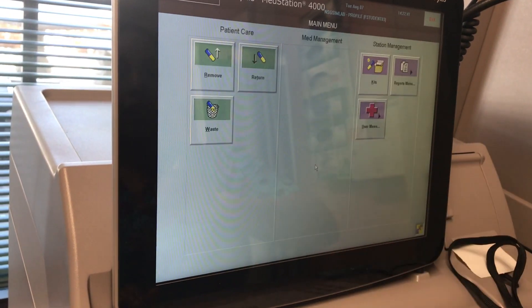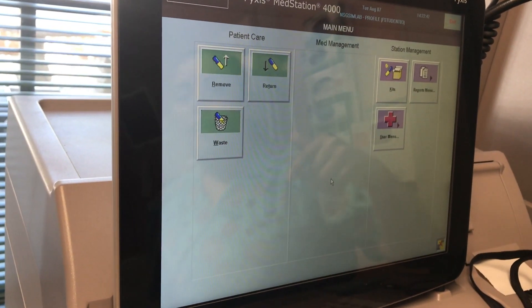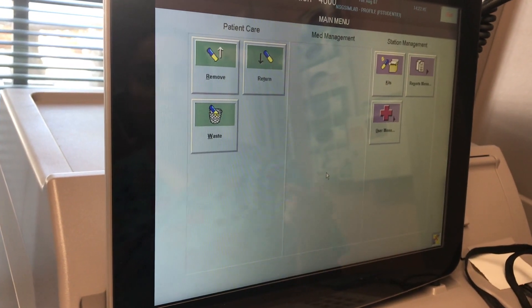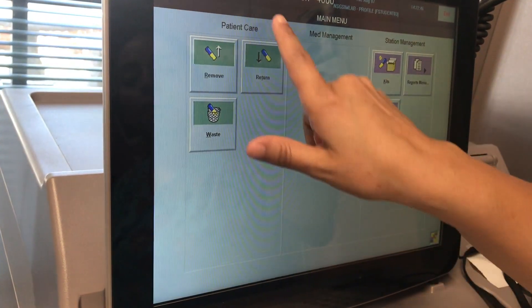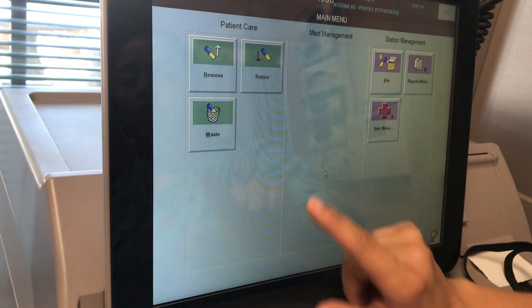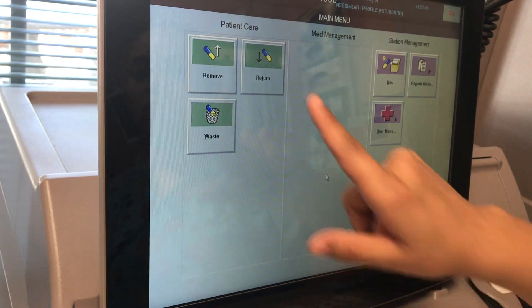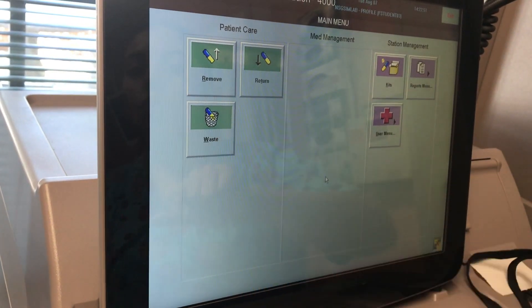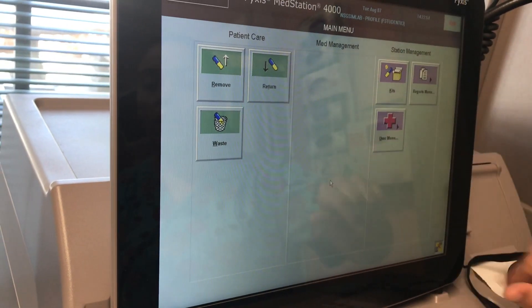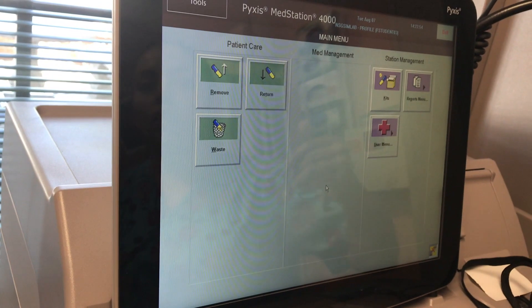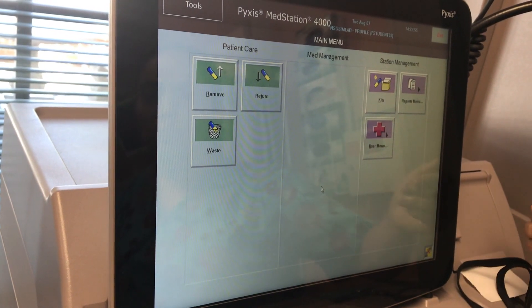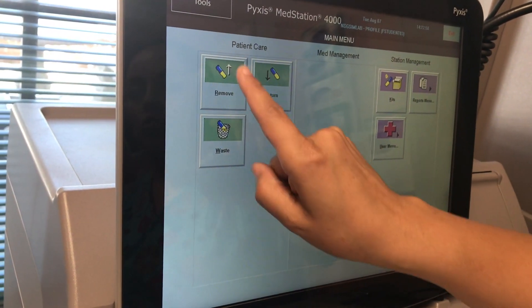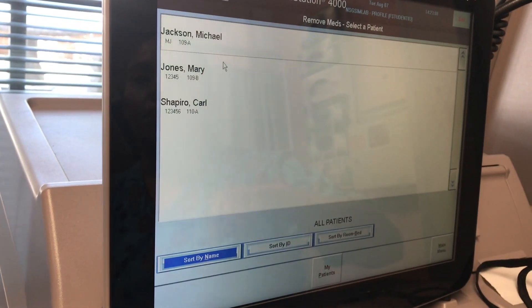Click OK. This screen allows me to do several things. In the patient care section it allows me to remove medication, return medication, or waste medication among other options. In this demonstration I am going to remove a medication, so I am going to press Remove.